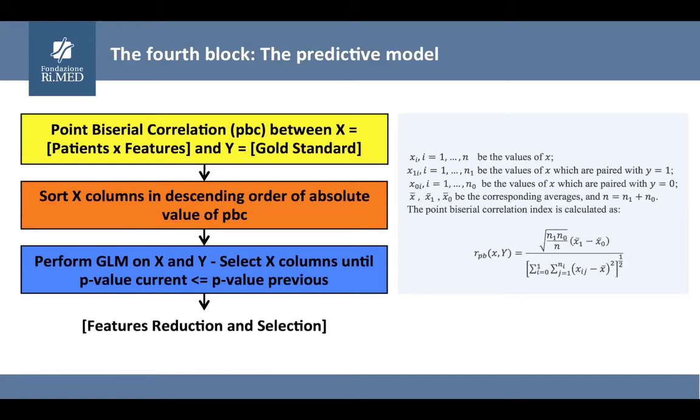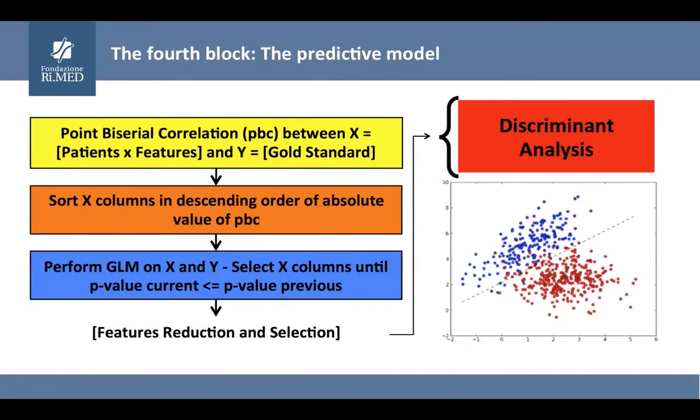In the fourth step, the discriminant analysis is used to create a predictive model on our patient dataset. We train the discriminant analysis to separate target texture radiomics features in two classes: no prostate cancer and prostate cancer. The training task needs to be performed only once, and when complete, the discriminant analysis is ready to classify newly encoded radiomics texture. To generate the training input to the classifier, the results of histological examination are used as the gold standard.